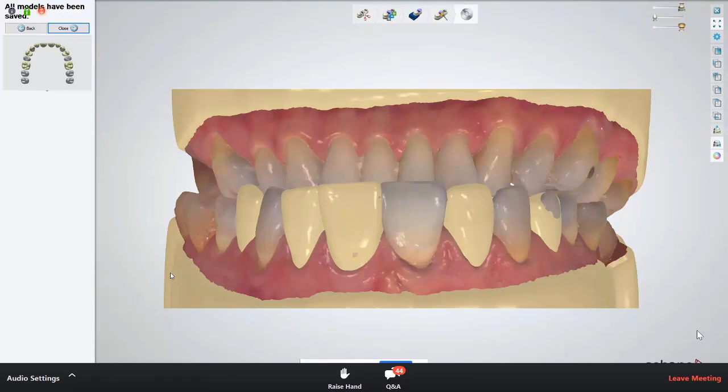There will be lines, of course, in the mold, and when the doctor injects it, he has to polish them away. However, normally the doctor needs to polish the composite anyway, since it has an inhibition layer on top, and when he polishes the inhibition layer away, then most of the lines disappear anyway.